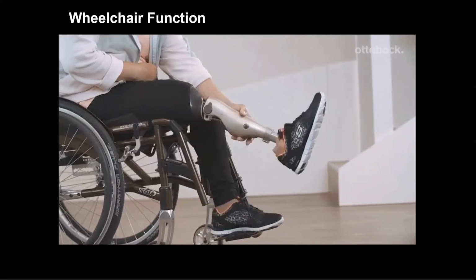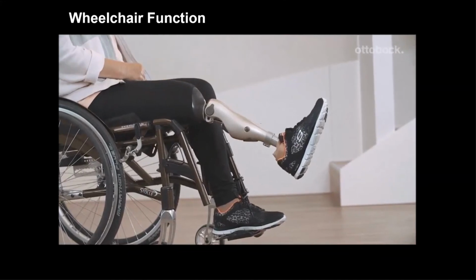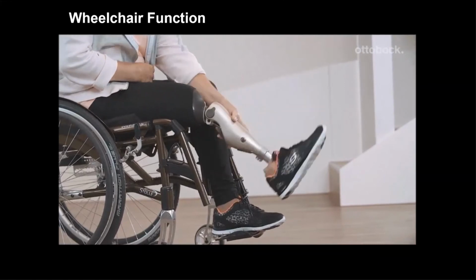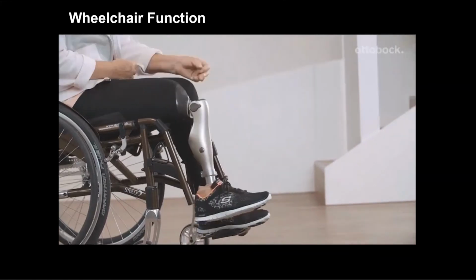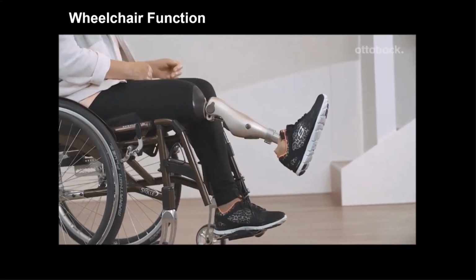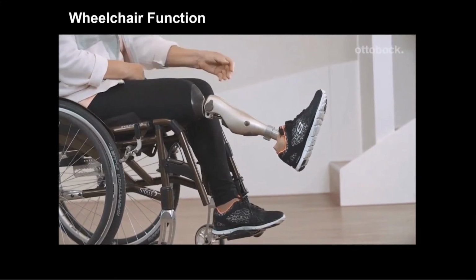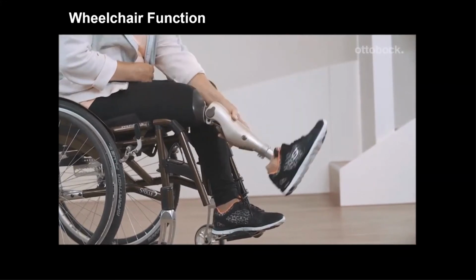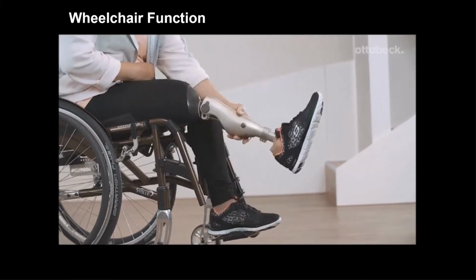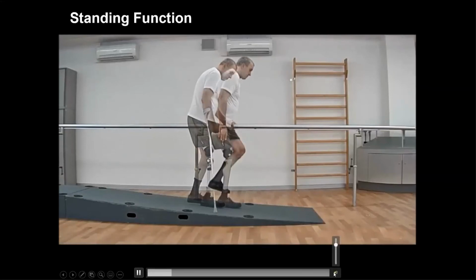And a neat feature in the Kenevo is that it has what's called a wheelchair function. The individual can position the knee in a slightly flexed position and it will stay there so that their caregiver can push them in the wheelchair and they don't have to use their contralateral or their sound leg to lift it off the ground as their caregiver is pushing them. Really nice feature and easy to manipulate by the user.